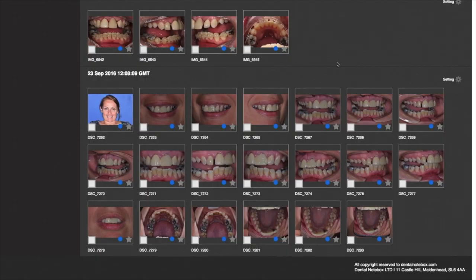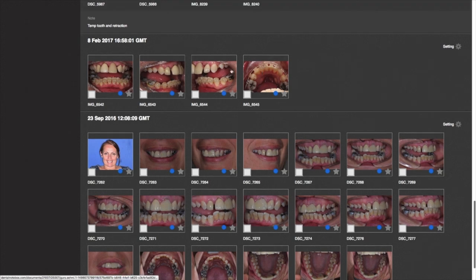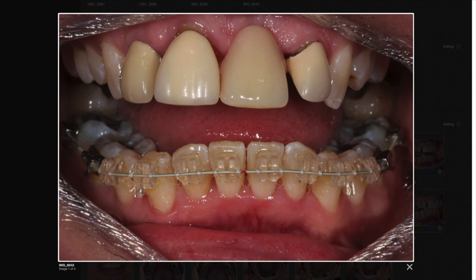This is how we did it. As you can see, we've got a fixed brace on the lower teeth. That's all we needed to do - just get the teeth all aligned and help intrude that anterior segment. Just by working through a normal wire sequence, probably an 18, 18, 20, 20 wire or something like that, we were able to just level out that lower arch.